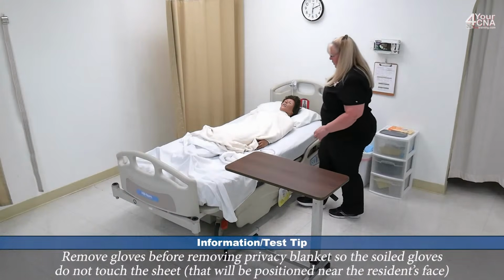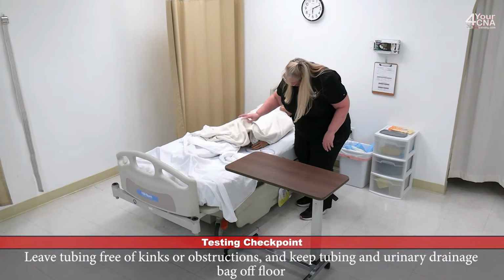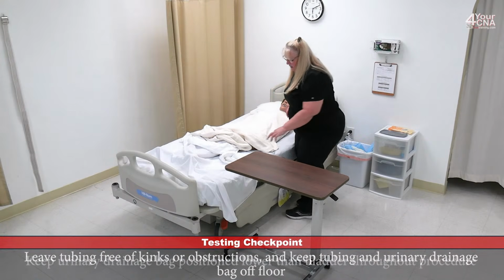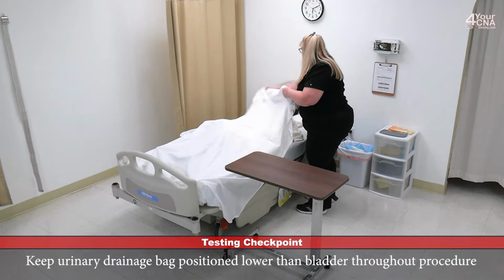Okay, Ms. Jones, I'm going to remove your privacy blanket now. I want to check your tubing real quick just to make sure that it's not kinked and you're not lying on it. So it looks good. It's not near the floor. So I'll pull the sheet up over the privacy blanket. This ensures that you're always covered.